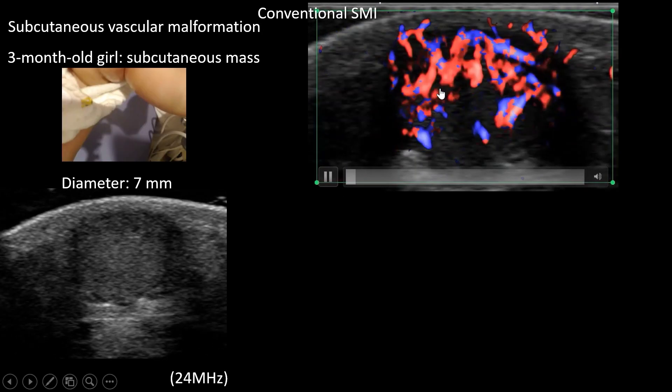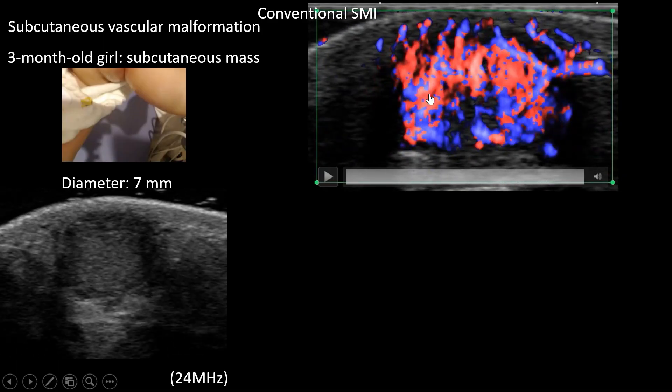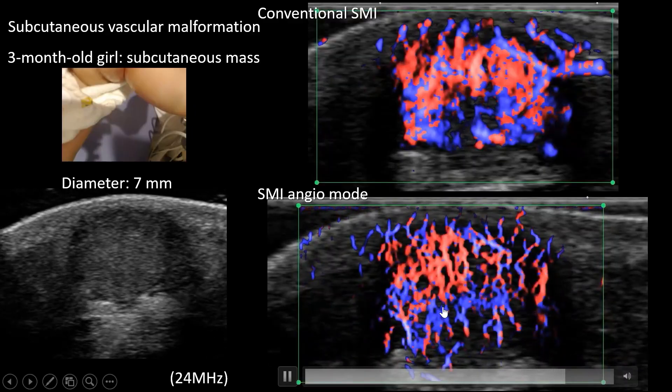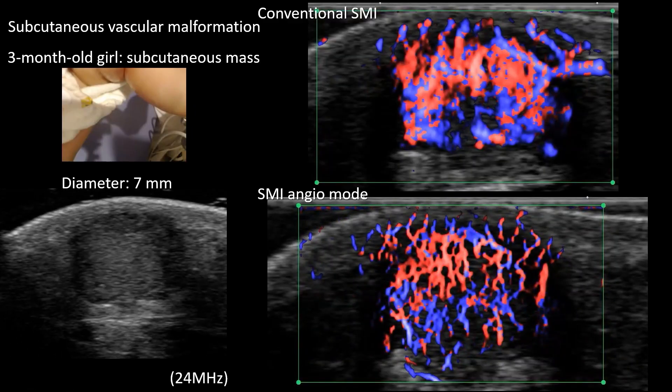This is an interesting case — a three-month-old girl. Her parent felt a subcutaneous mass. On grayscale you can find a mass whose diameter is only seven millimeters. By using conventional SMI you can see bundles of blood vessels. By using SMI Angio Mode you can see finer and finer vessels inside this mass. This is a vascular malformation.